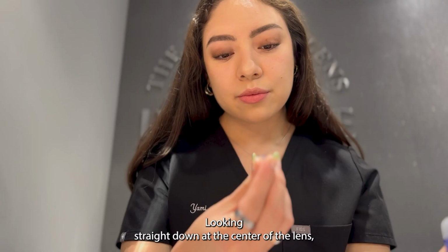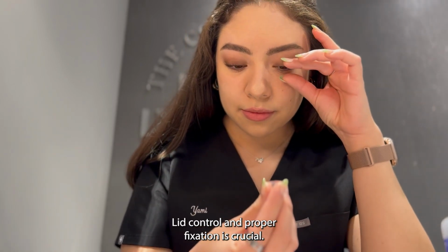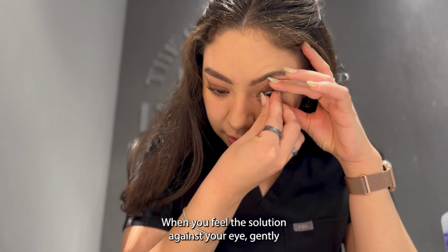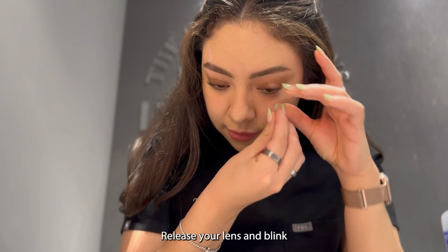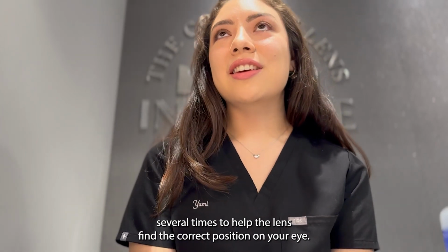Looking straight down at the center of the lens, hold your eyelids open with your non-dominant hand. Lid control and proper fixation is crucial. Move the lens towards the center of your eye. When you feel the solution against your eye, gently press the lens to your eye and let go of the lens and your eyelids. The lens will then adhere to your eye. Release your lens and blink several times to help the lens find the correct position on your eye.